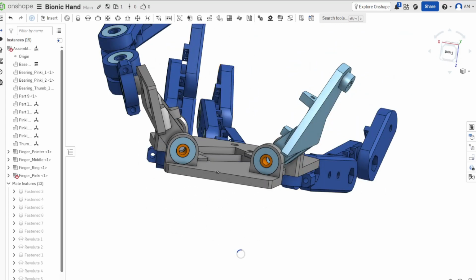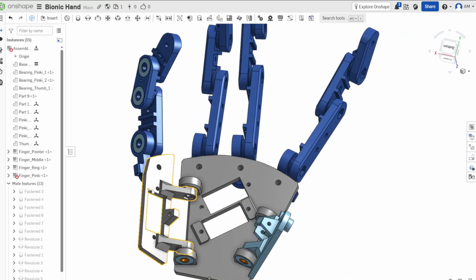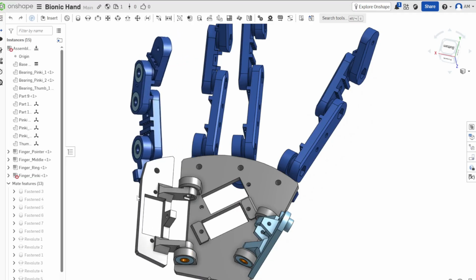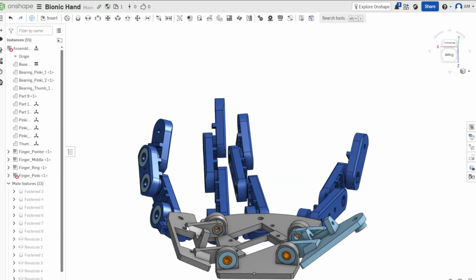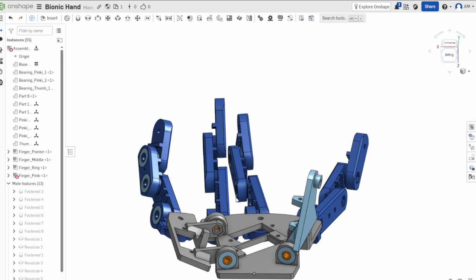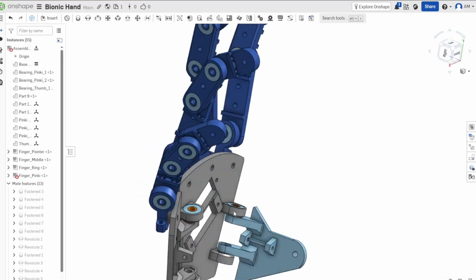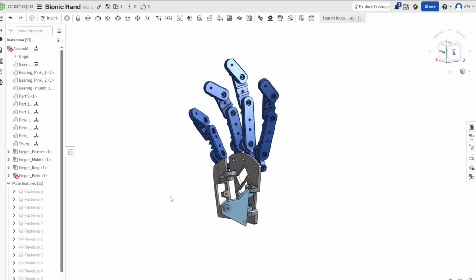I noticed, just look at my own hand, you really don't do one without the other. You often don't move your pinky in unless you're moving your thumb across, and vice versa. I'll probably have this mechanically just move about half the distance as this does, because that feels a bit more natural, as well as all the tendons I use. I'll probably use something with a bit of elasticity to allow for a good gentle grabbing.